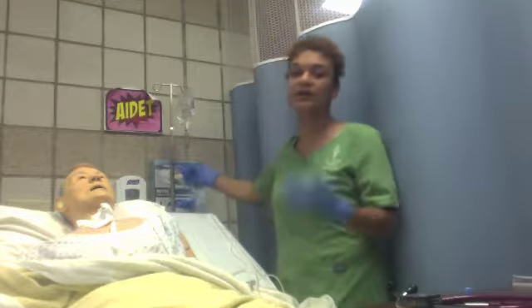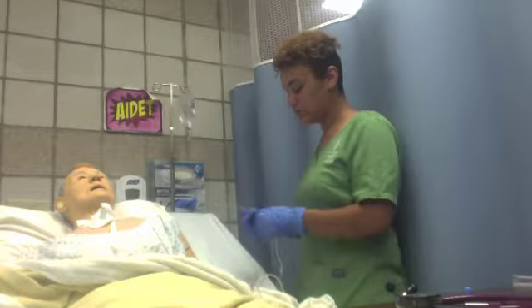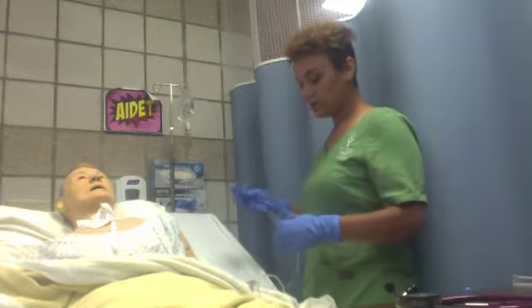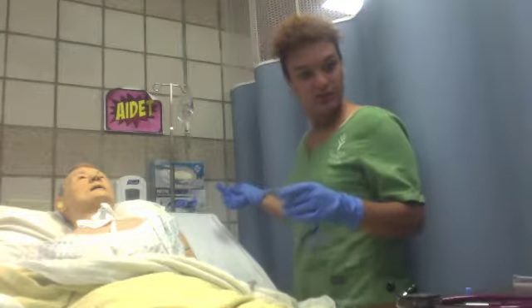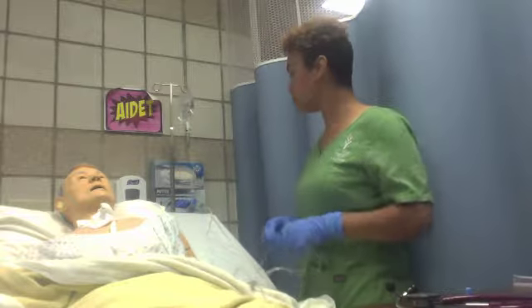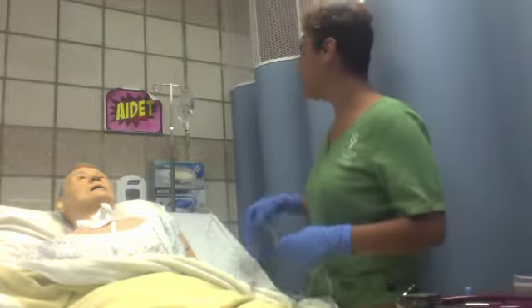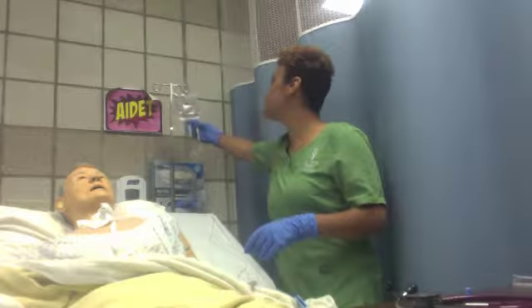Looking to make sure all the clamps are open, making sure there's no leakage throughout the tubing. The tubing is patent, looks accurate, and making sure that, again, all the clamps are open, that the flow is correct, making sure there's proper placement.